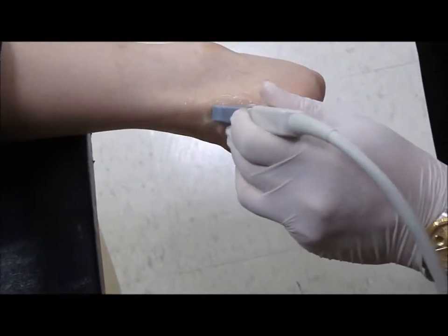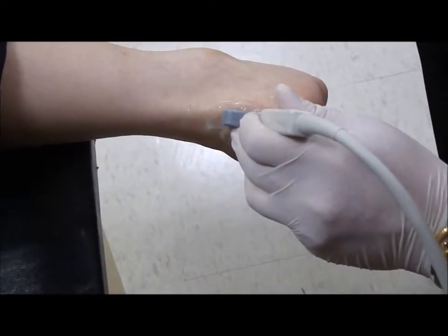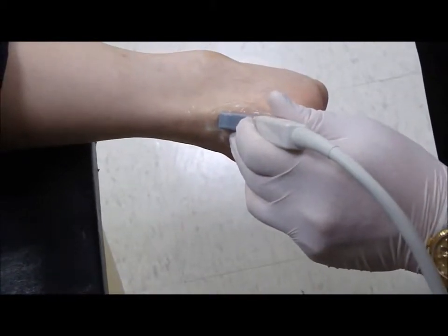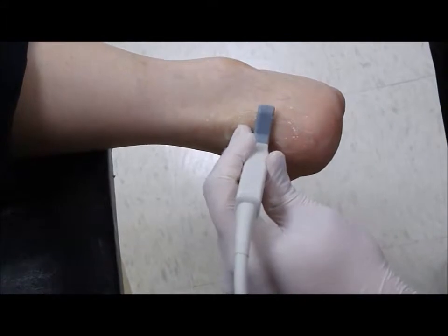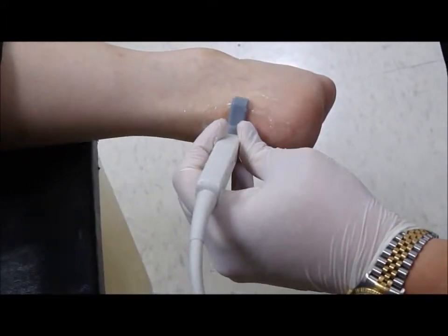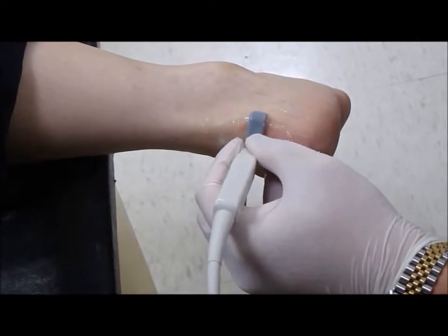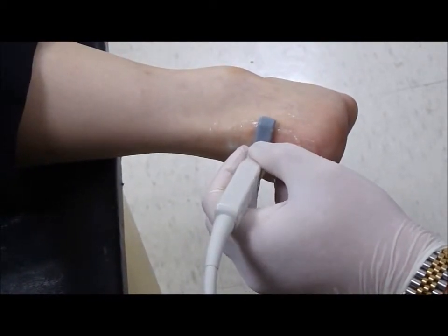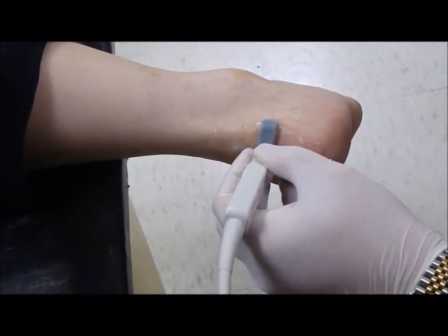Again, the transducer is placed in the sagittal plane to view the sonographic images of the retrocalcuneal bursa. When you turn the transducer by 90 degrees, you can then see the transverse view of the retrocalcuneal bursa.